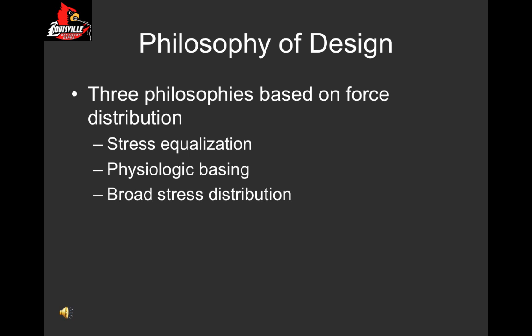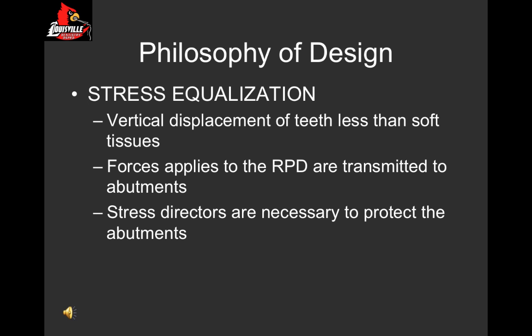There are three factors in the philosophy of design related to force distribution. One is stress equalization, the second one, physiologic basing, and the third, broad stress distribution. Let's talk about stress equalization.